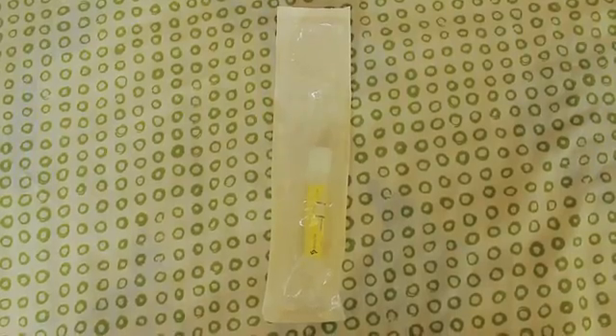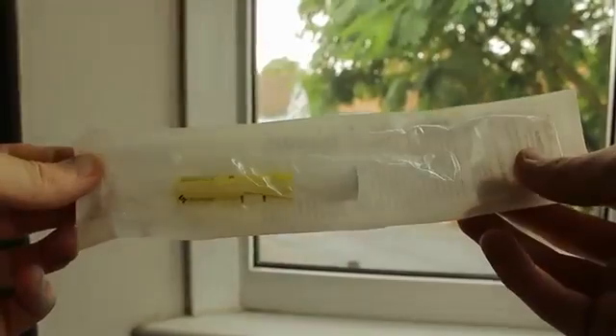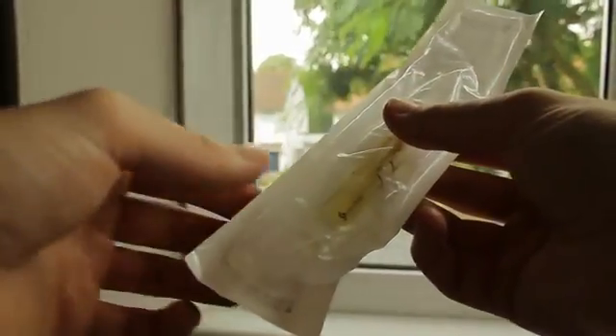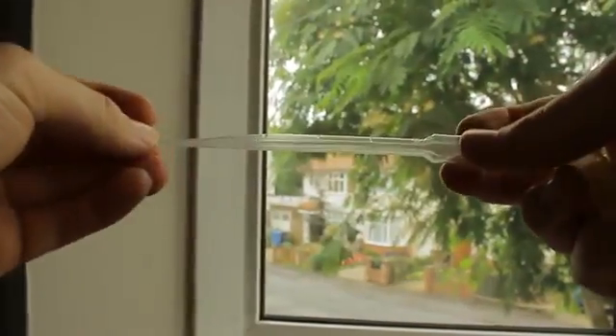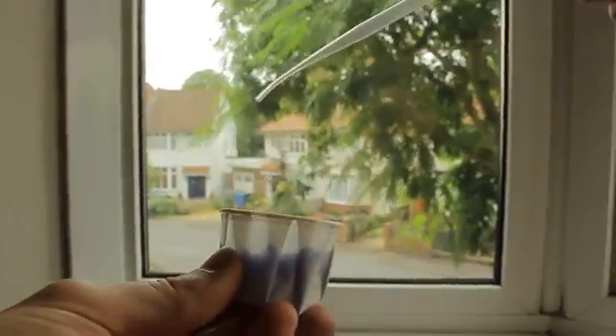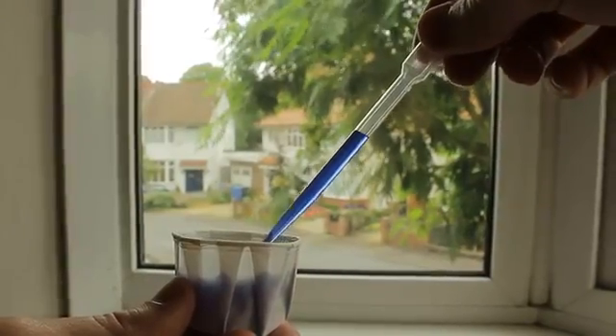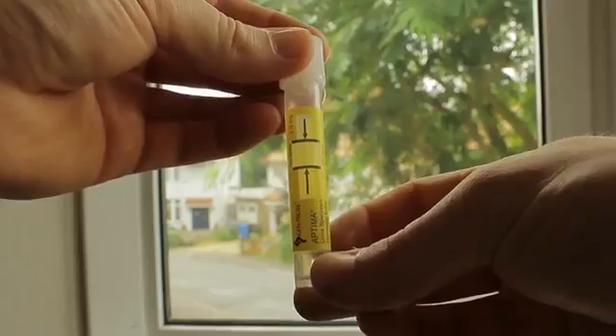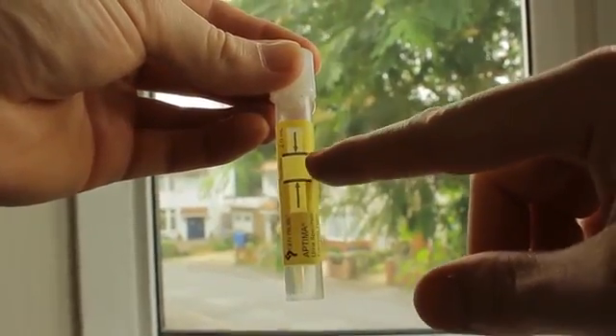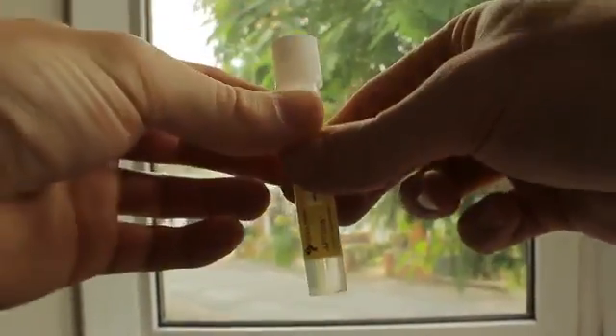Now you'll need the test tube and the pipette. Although not too clear, the pipette is included in the same packet as the test tube. When you've opened the sealed package, grab the pipette first. With the test tube, make sure you put the sample in between these black lines.